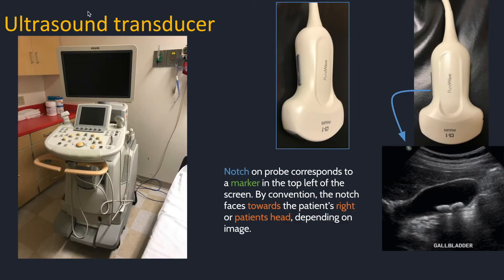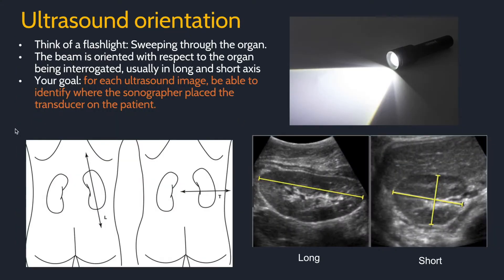One of the most difficult parts of learning ultrasound is just getting oriented to each image. Here is an ultrasound machine and a transducer. The notch in blue here corresponds to the marker on the top left of the screen. By convention, the notch is facing towards the patient's right or the patient's head, depending on the image. You can think of ultrasound like a flashlight — it sweeps through the organ with a beam oriented in relation to the organ rather than to the body, like CT and MRI. So for ultrasound, we say short axis and long axis of the organ.